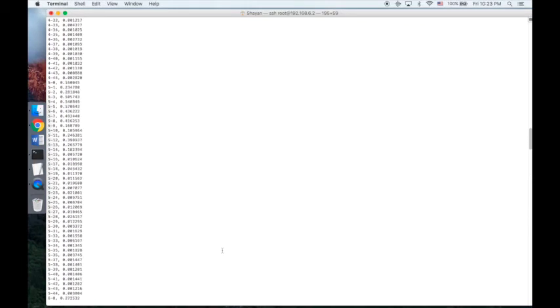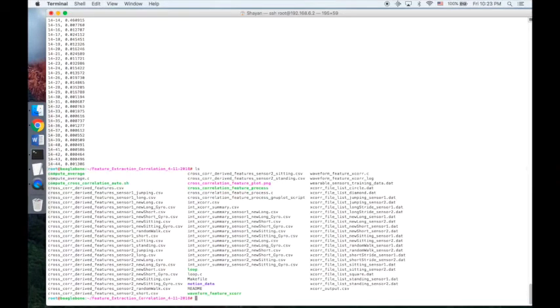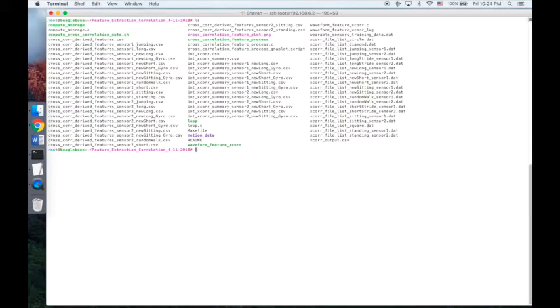Now, we did not specifically get our features from this output file because to our senses the autocorrelation was more distinct. Now the integrated X-core summary outputs the cross correlations and autocorrelations for the files that you include in your X-core file list. I will demonstrate the examples here.